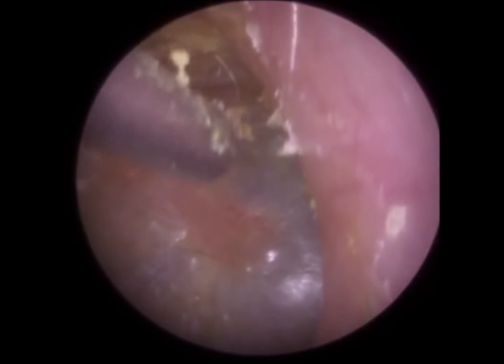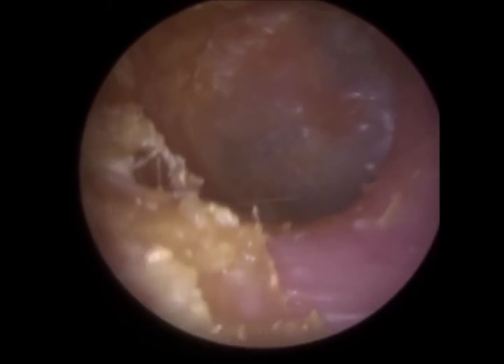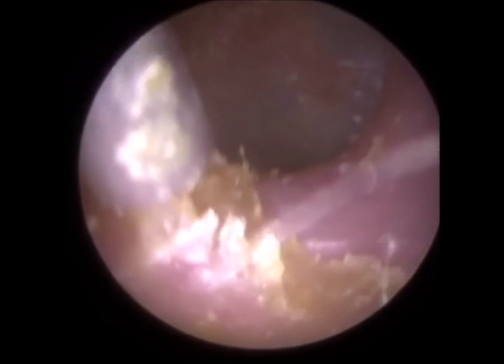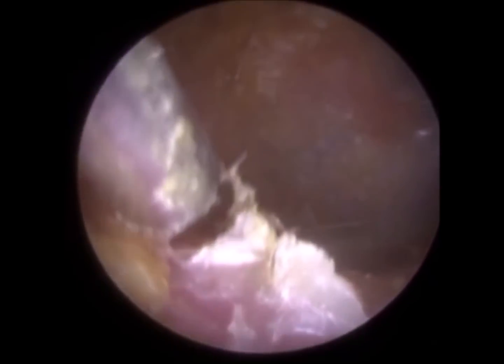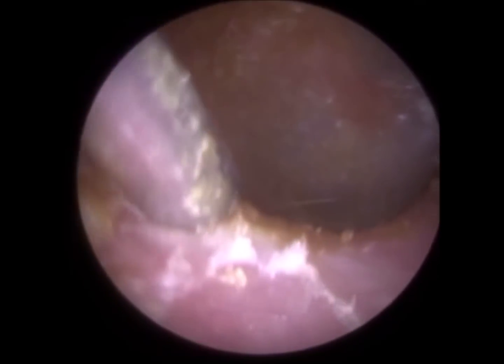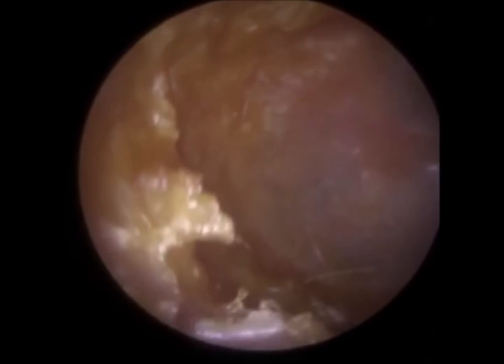touching the bony part. I don't know whether anyone's played that game growing up called Operation, where you're trying to remove bits from different parts of the body, and if you come in contact with the fleshy part of the body, you get a buzz. So it's almost like that when you're deep in the ear. When you're in the outer part of the ear canal, then you can make more contact with the ear canal, because that's cartilage. You've got a bit of fatty tissue there. The skin's a bit thicker, about 1 millimeter in thickness, so 10 times thicker than the skin that coats the inner two thirds.